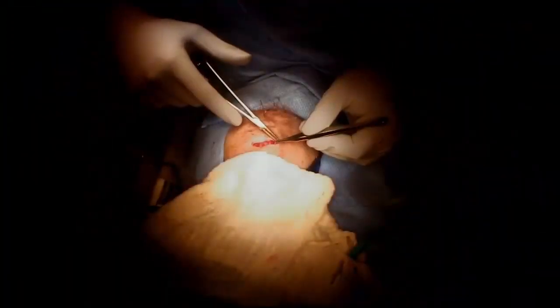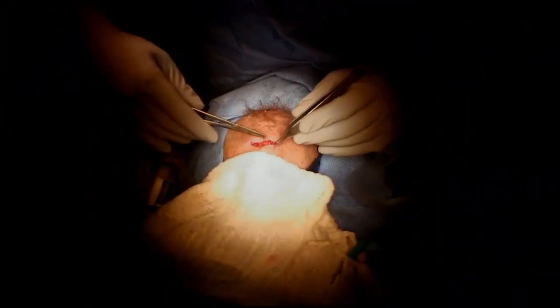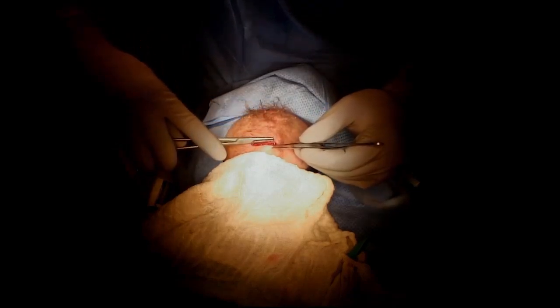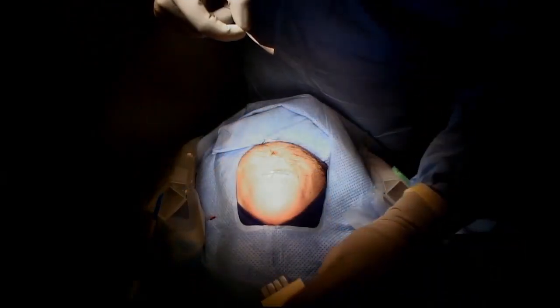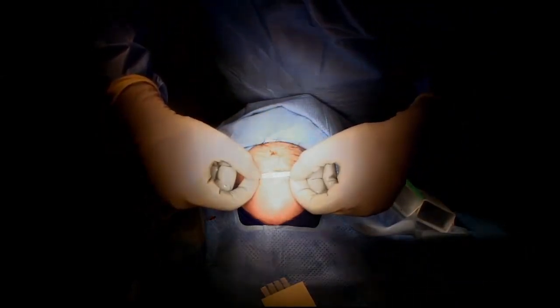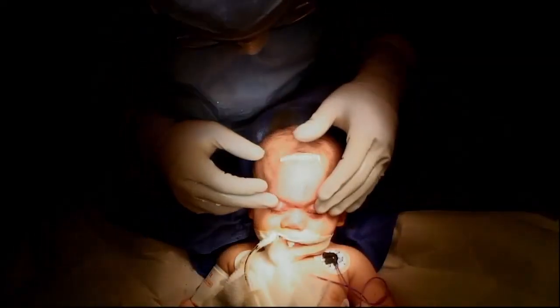Surgiflo is generously placed on the suture and osteotomy site. Finally, the galea is closed with Monocryl, and then the skin is closed with Mastisol and steri-strips. There is very little swelling associated with this procedure and excellent results at the end of the treatment.